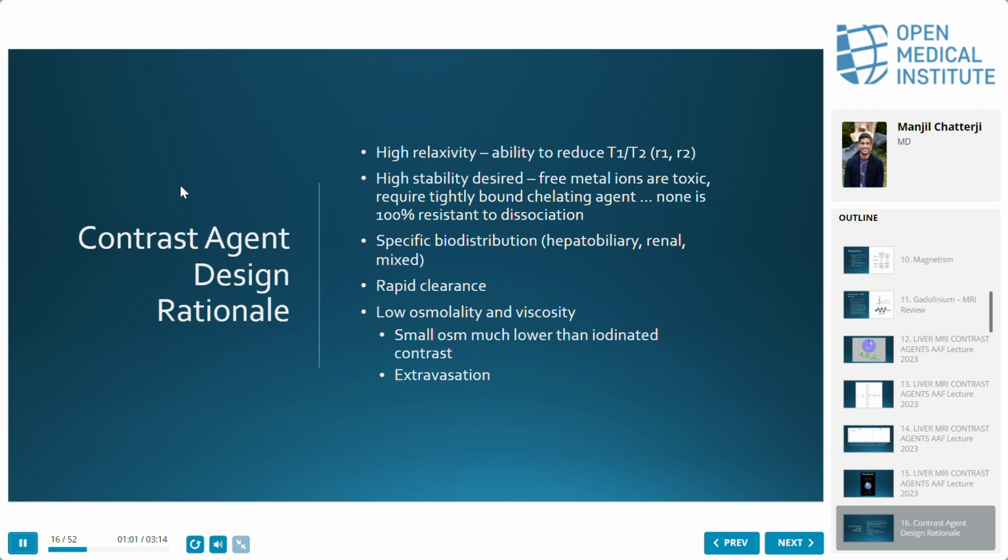T1 for contrast at human concentrations is where that's our bread and butter, which is why we don't really do T2 weighted imaging after contrast, because at our concentrations, the effect on T1 is so great. Other questions about the physics?